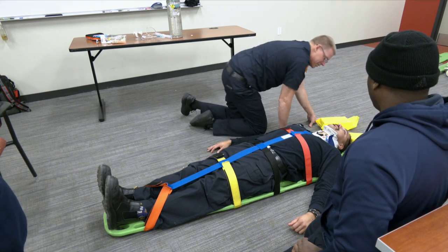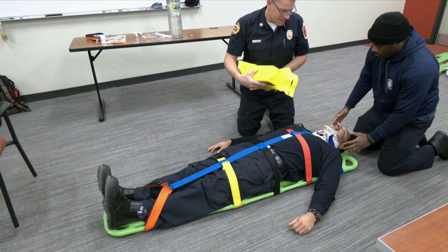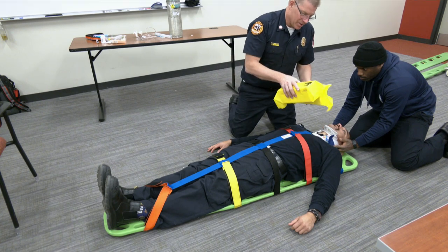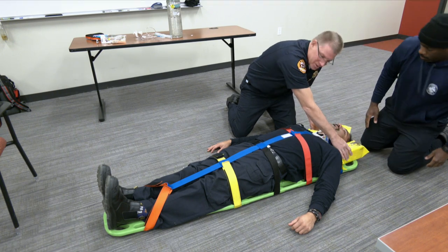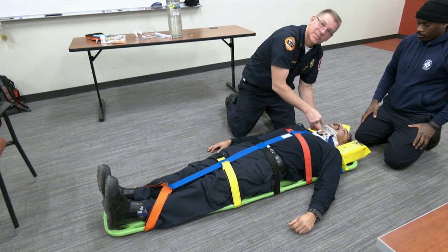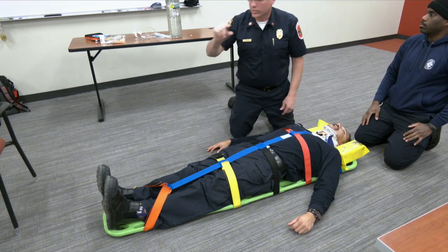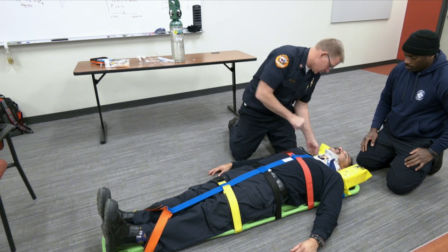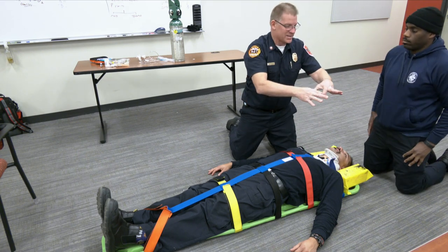Then we're going to apply the head blocks — remember, somebody's got C-spine this whole time. When they're holding C-spine, we take both head blocks and put them on at the same time. He's been holding C-spine from the onset, we put on the collar, still holding, let them roll the patient, put them on the board. Now we take the head blocks, keep your hands there, and slowly move out. We move those blocks right in, then we tape. We come here, bring the tape down, hit the C-collar, and come up — creating a U shape. Then we go on the forehead, catch low, fold it over two-thirds of the way. We use three-inch tape, so it should only cover about a half inch on the forehead. Then we go over and back down on the other side, creating an X on the sides.